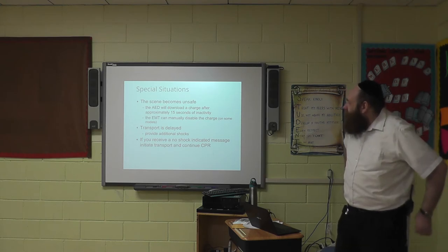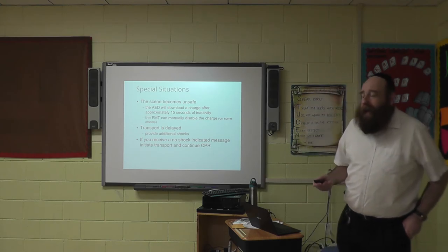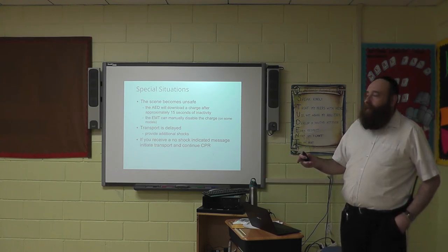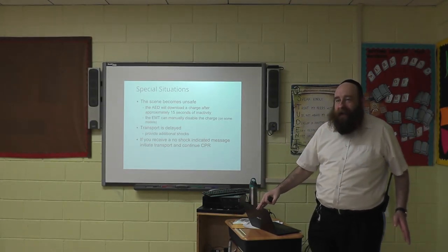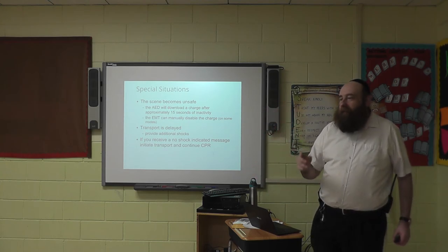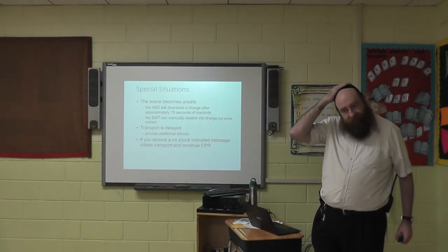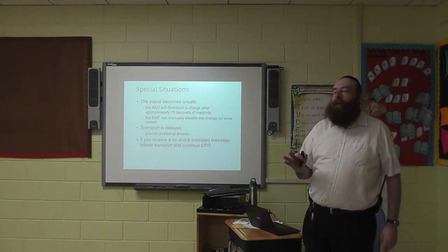Special situations, I don't really worry about this too much. Obviously, sometimes you're ready to shock and it says shock advised and you're clearing everybody, and all of a sudden Bob sits up and goes, hello. Probably shouldn't shock him at that point. Why is my chest shaking? Okay. Yeah.